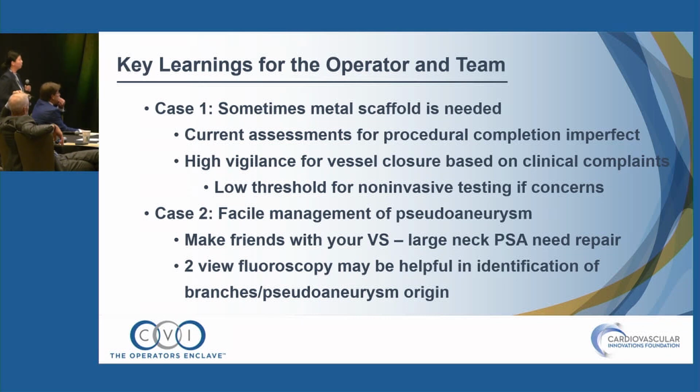Very high vigilance for vessel closure based on the patient's clinical presentation, and low threshold for non-invasive testing if there's residual concerns. Case two, facile management of pseudoaneurysms. Make friends with your vascular surgeons. You will need their help one way or another someday.